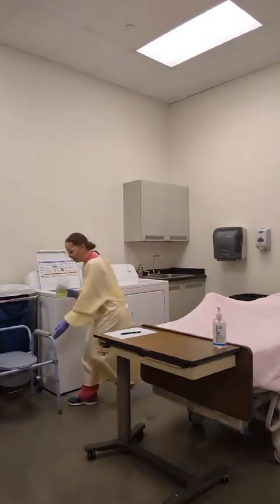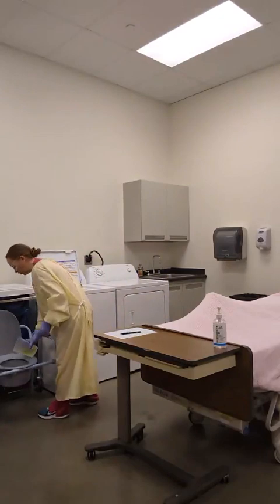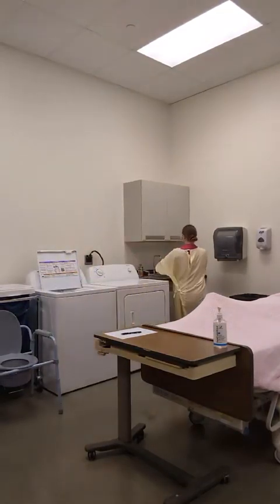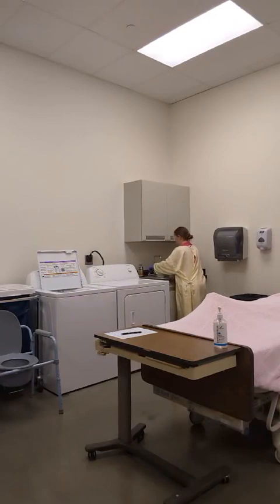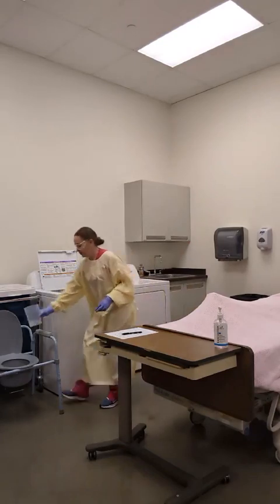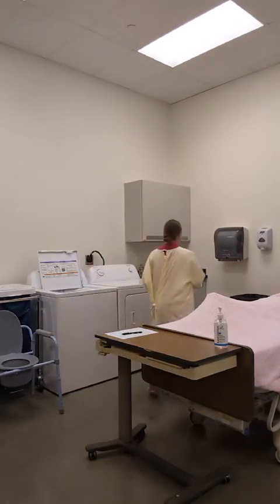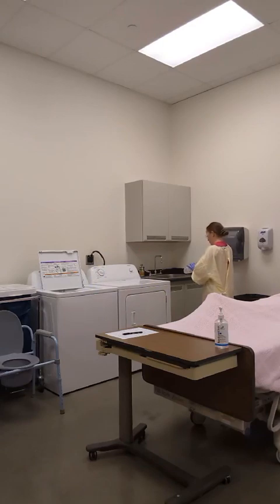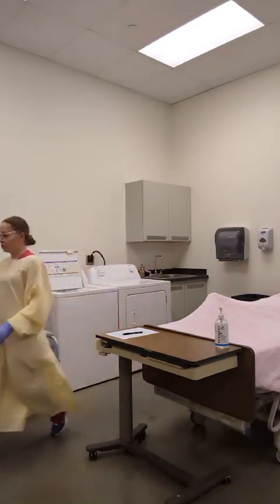I will empty my urine into the designated toilet. I will then rinse my graduate and dry my graduate before returning it to storage.